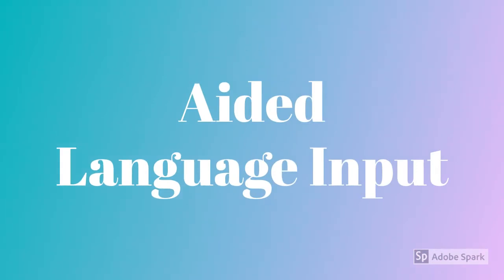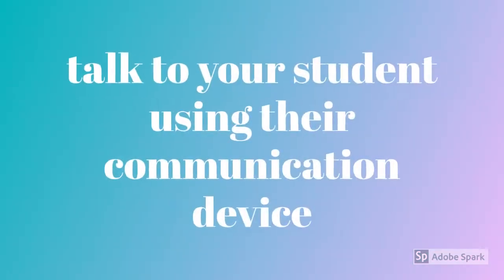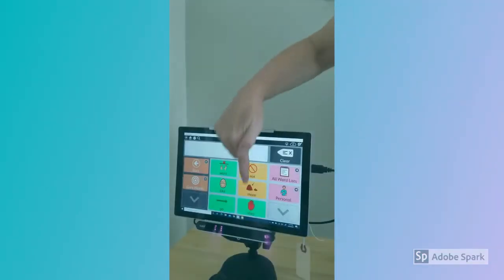Keep in mind that your student doesn't know what all of the symbols on the device mean. You will have to teach them that. One strategy is to use aided language input. That's just a fancy way of saying, talk to your student using their communication device.